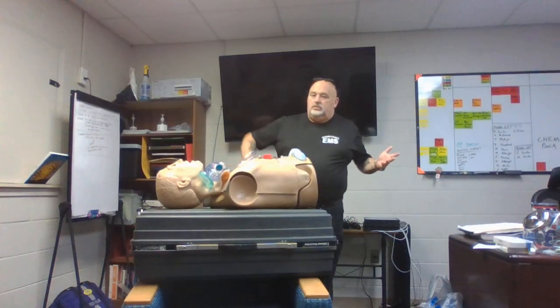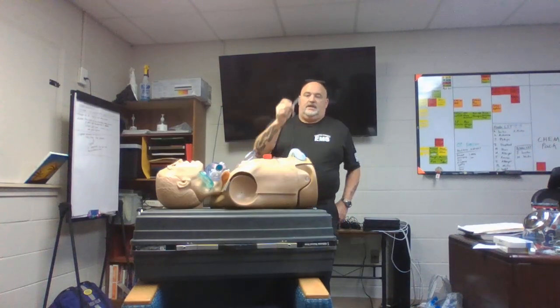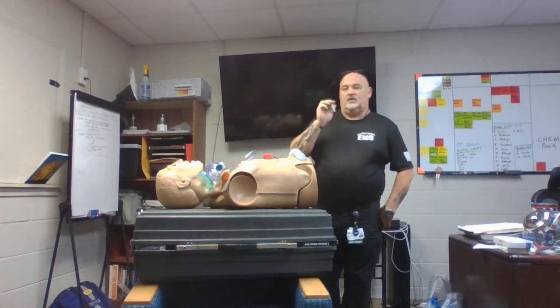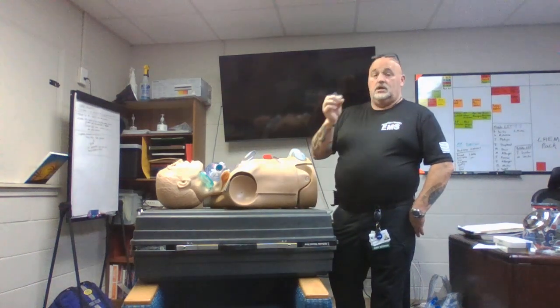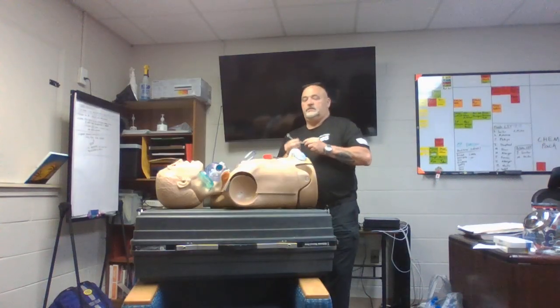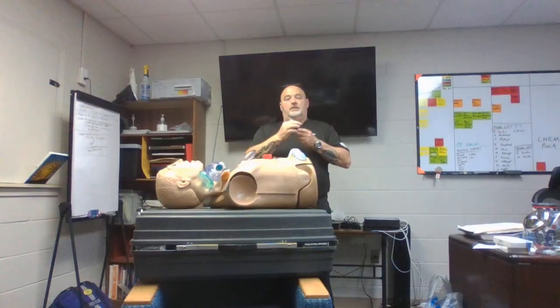Because a long time ago, this is what I was taught, somebody put one of these in, and because of the trauma to the head, it magically turned and went to the brain. So for eons, we don't teach to insert these if we suspect head trauma, right?